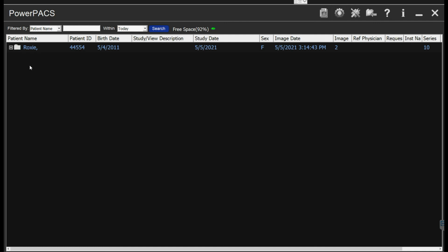So our typical configuration with a PACS like this would be to put it on a 4 terabyte RAID 1 tower. So that's 2 4 terabyte drives, one mirrored by the other. In case you were to lose a drive, you'd have all your information on the other drive. So that's how Taiba Enterprises configures and sets up these PACS.